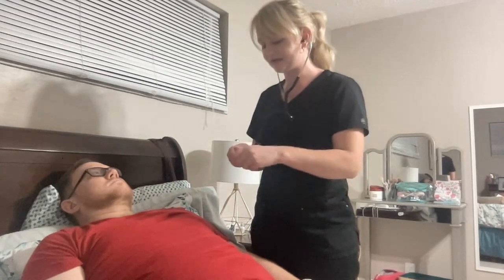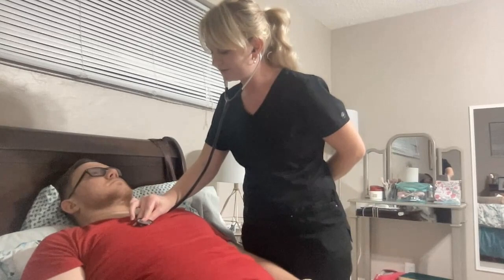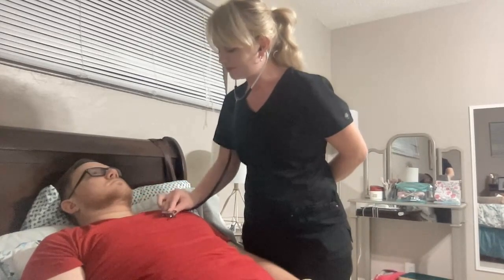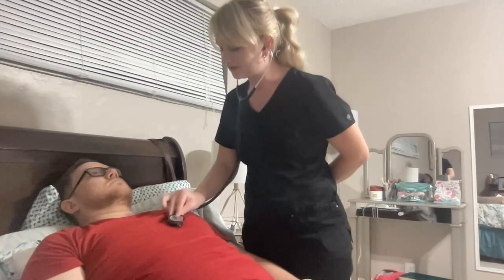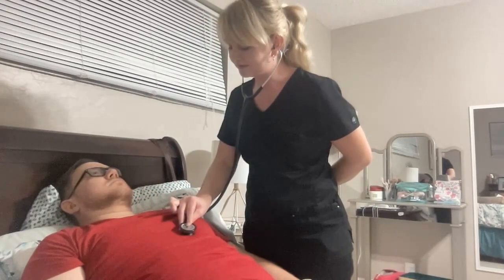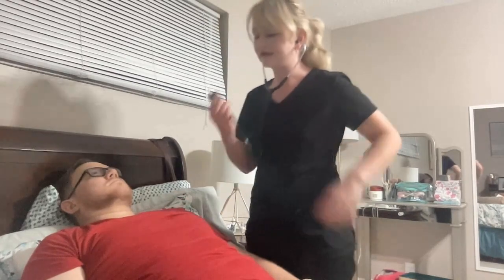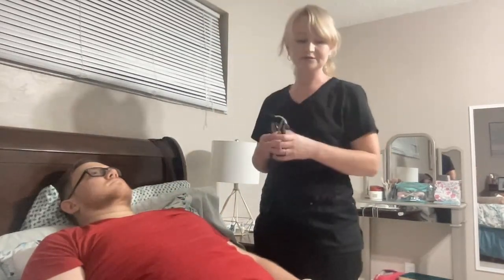Now switching to the bell of my stethoscope. Again, aortic, pulmonic, Erb's point, tricuspid, and the mitral. And no murmurs were heard upon auscultation.